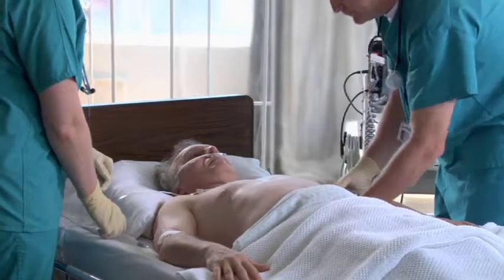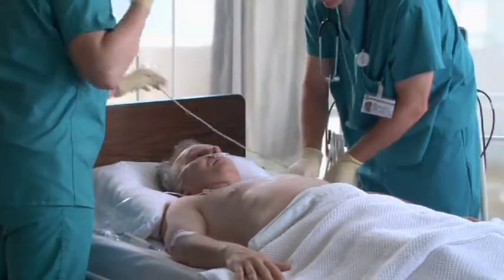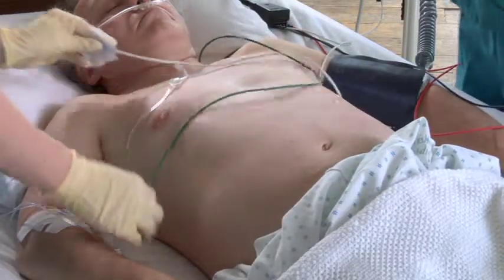The LifePak 15 monitor defibrillator can be used for either demand or non-demand pacing. Demand pacing is used for most patients, so that's what we'll show here. First of all, before you start pacing someone, always consider the need for patient analgesia or sedation. Okay, connect the ECG leads to the patient.